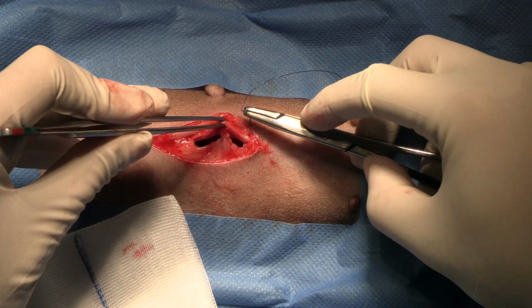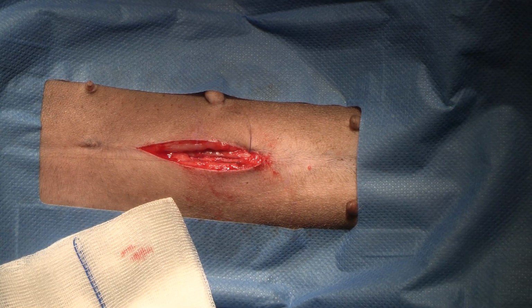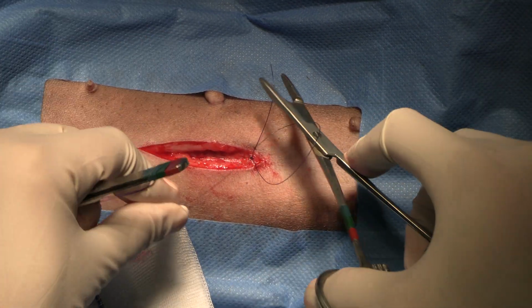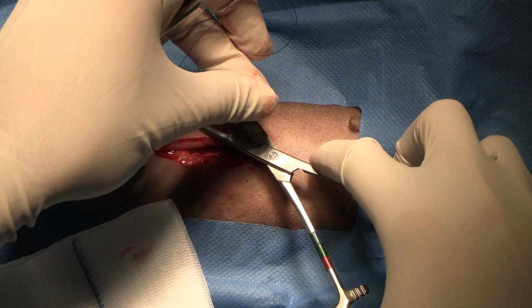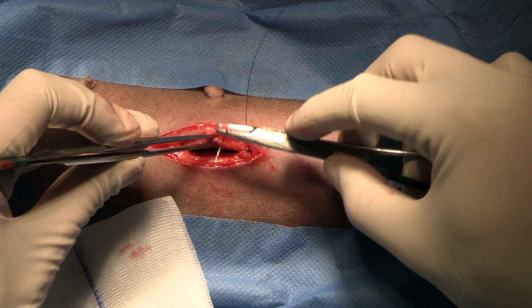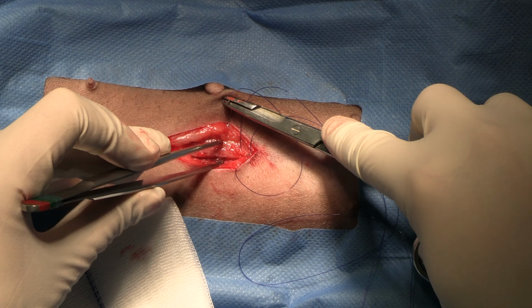This is a surgical AI, certainly still done and legal where we are, but it is done less and less. There is an alternative, which is a great thing, which is called a TCI, a transcervical insemination. Certainly we do a lot of those, and certainly as far as success goes, I would say a TCI is absolutely comparable to a surgical, and it's only getting better as we get more skilled at doing it. So I imagine at some stage no one will be doing surgicals, at least in this country.